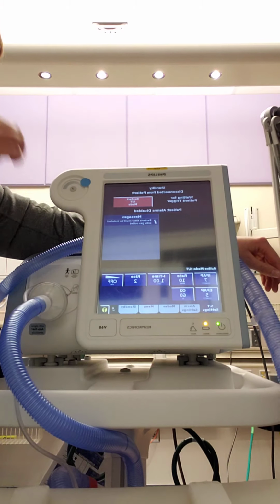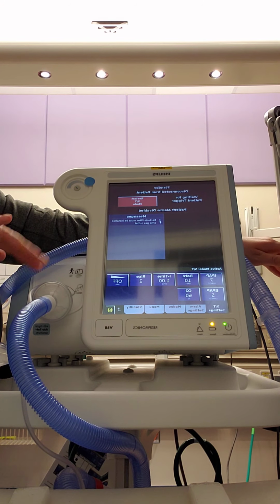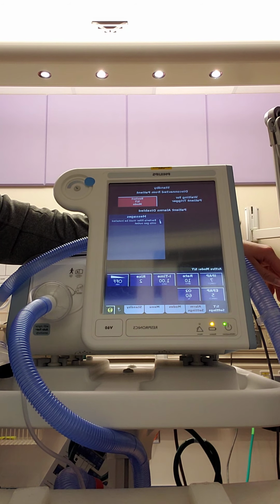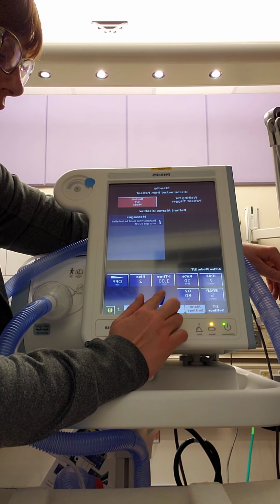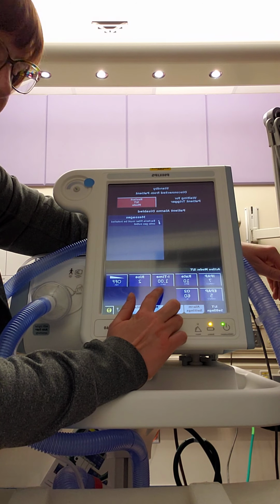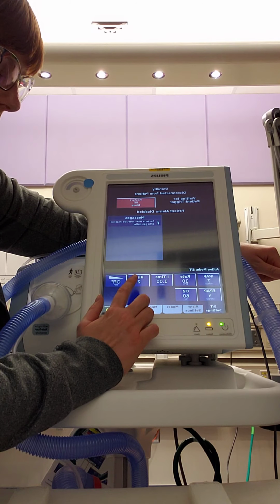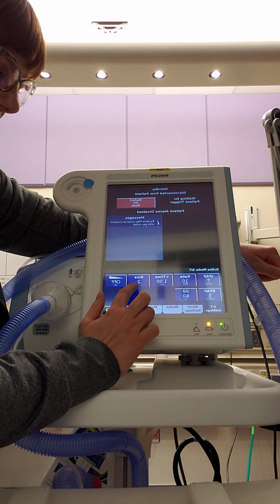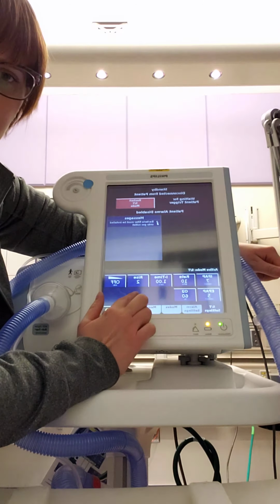The analogy I like to use is, so you guys are going to hear me talk about Artie a lot in this class. She's my dog. When I take Artie in the car and she's seatbelted in, she loves sticking her head out the window. So let's just say she sticks her head out the window for 1 second, which is our I time. But she's going to feel it differently if I'm going 15 miles an hour down the road or if I'm going 40 miles an hour down the road.